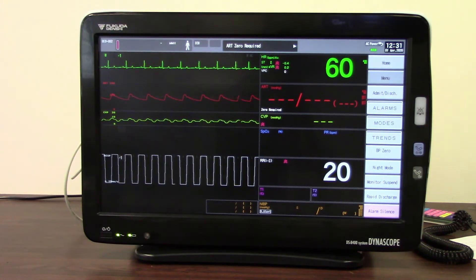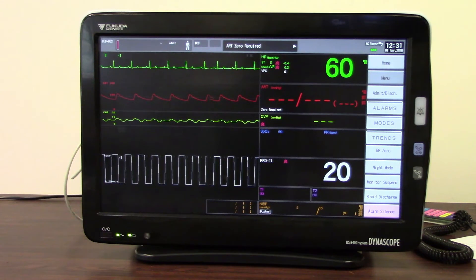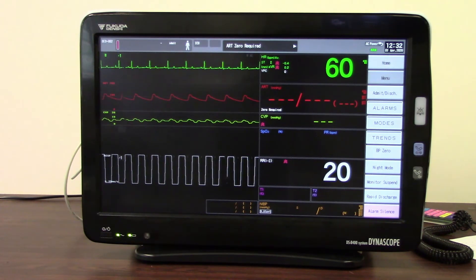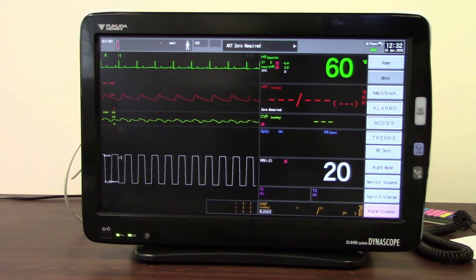Welcome to this short video training session for the Dynascope DS8400 monitor. This training session will demonstrate some of the features and functions within the monitor, mainly around displays and how to find various useful user keys that you might want to use.